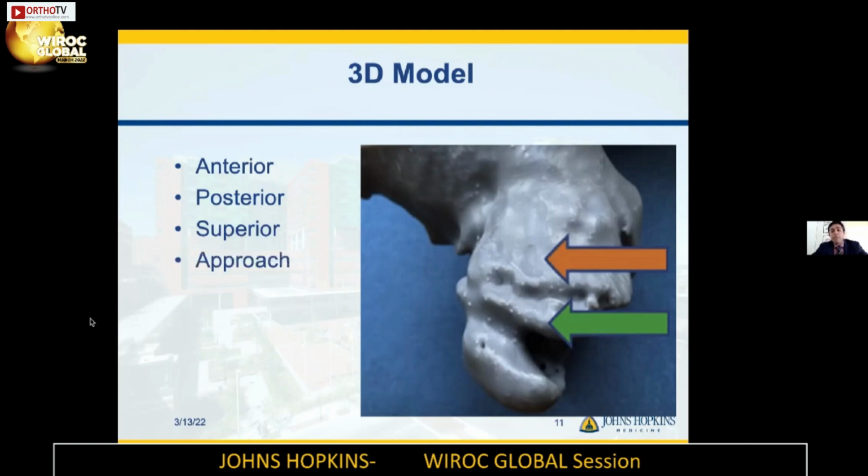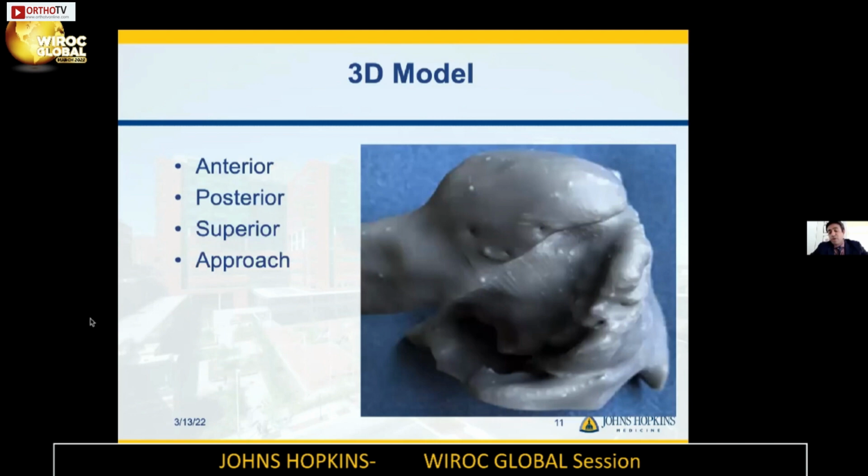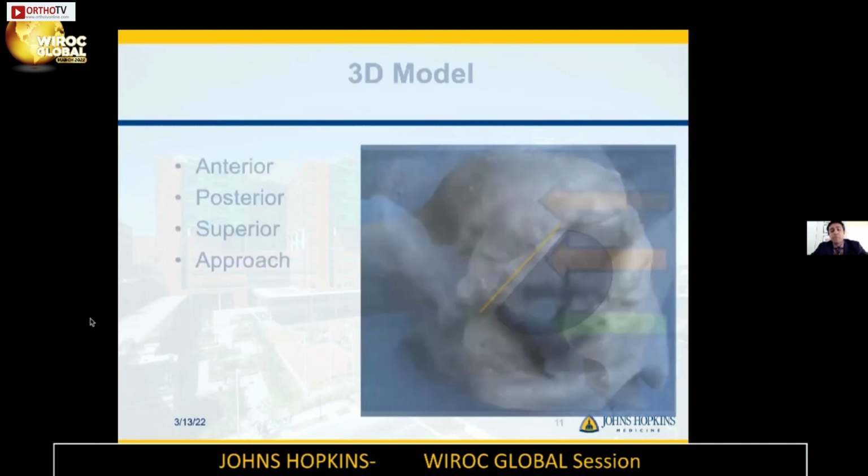And finally, if I was a posterolateral surgeon and an operating surgeon, and I'm looking at the patient, what would it look like to me? So this is the reconstruction where we can see our planned femoral neck resection. And this is what the acetabulum would look like in this patient. So I chose the standard posterolateral approach and extensile approach in my hands for such a difficult case.